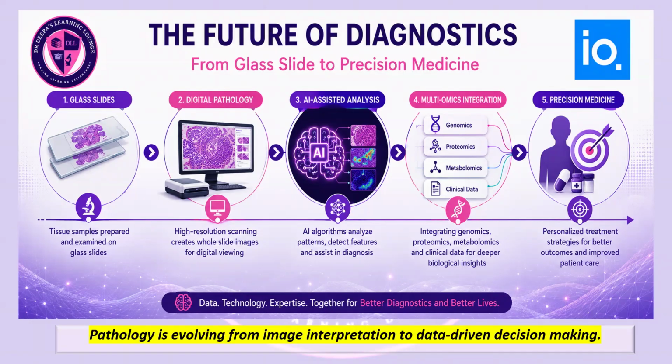The next stage of this evolution was beyond digital pathology, which is artificial intelligence. So what is an AI? AI allows the computers to analyze the digital images in ways that are beyond single image viewing. There are algorithms that are dedicatedly made and corrected and validated by pathologists in multiple places, who identify the cells, who detect the tumors, who count the mitotic figures, quantify the IHC markers. They assess tumor cellularity, and this entire thing is done in a very religious way, so that the AI is completely trained and ready for use.